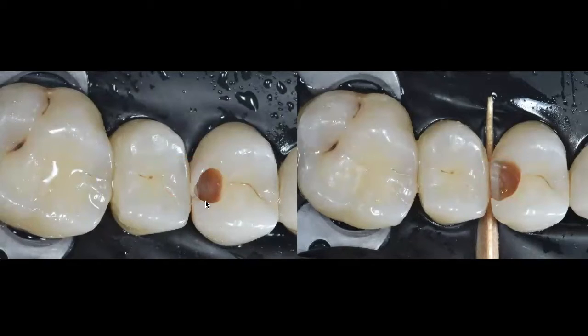You can see that this wall is literally crumbling down every time that I'm pushing with the burr. But what I'm trying to do again is eliminate this wall as low as possible, but as sure as possible, and without touching that neighboring tooth.